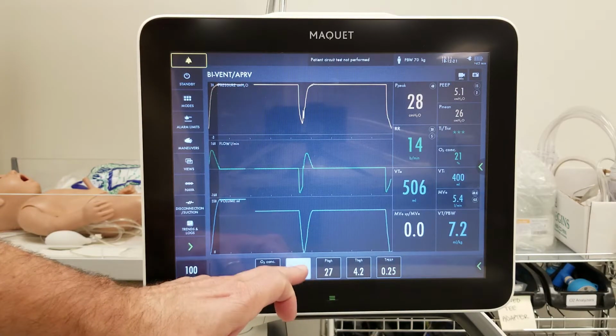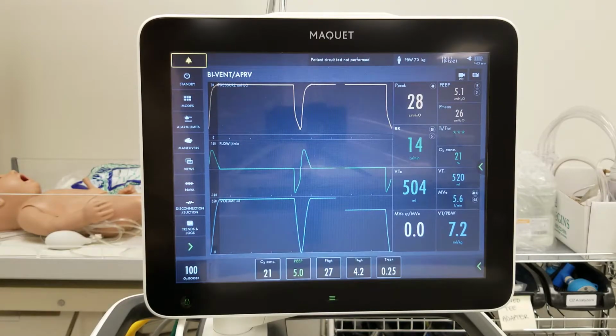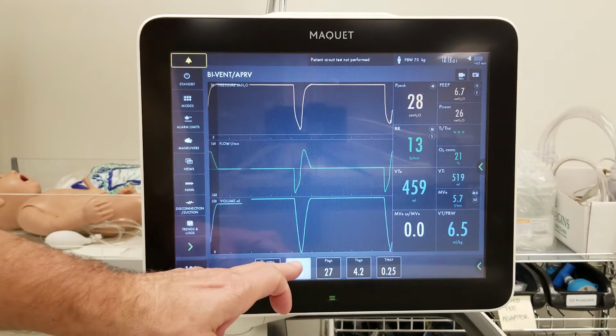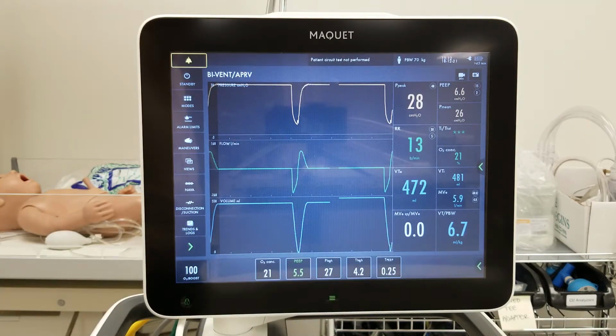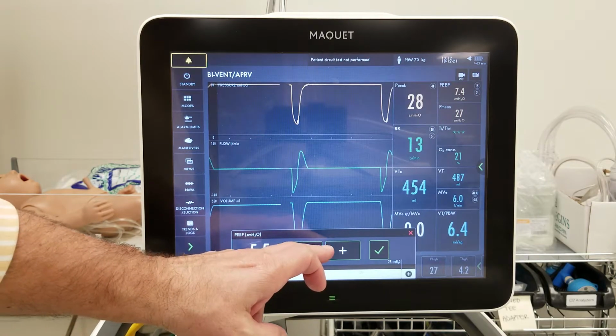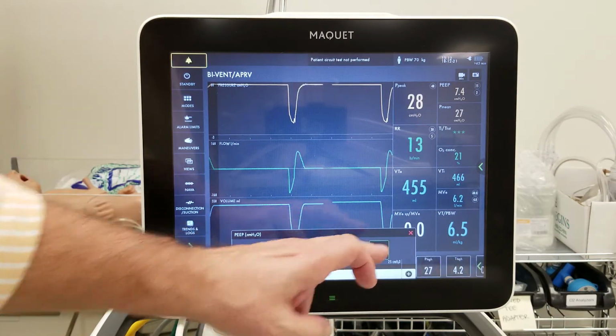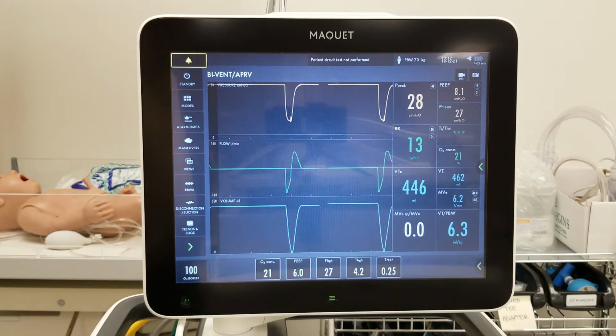Now we're way up. Okay, so let's go back up here. This is really the way we play in real life, so let's try one more. Let's try that. Four. There we go. So now we've got a little longer.